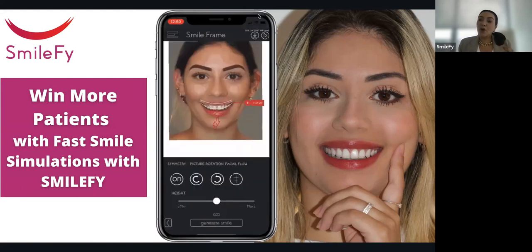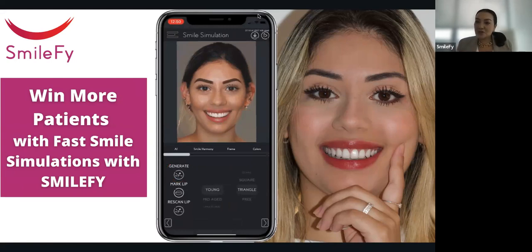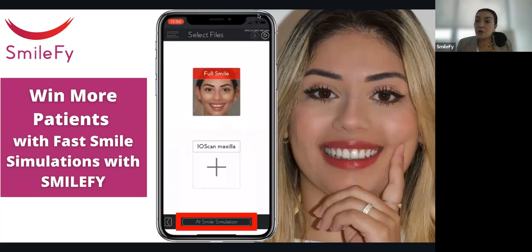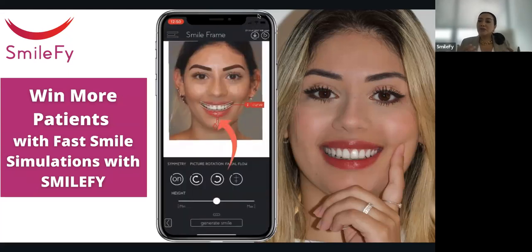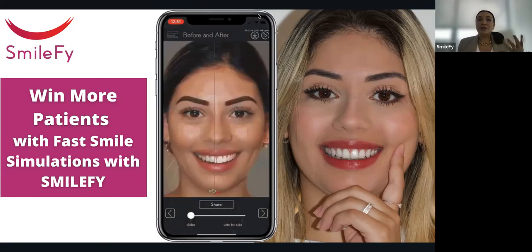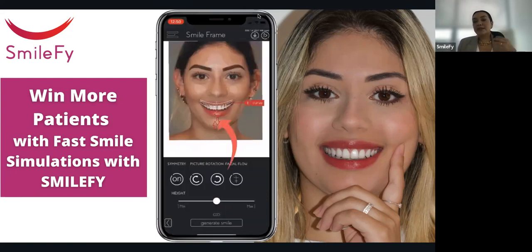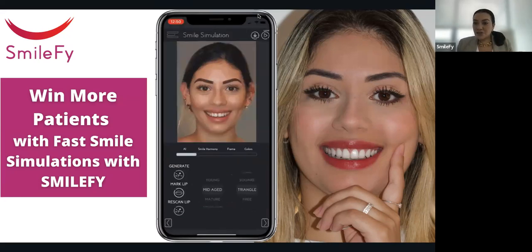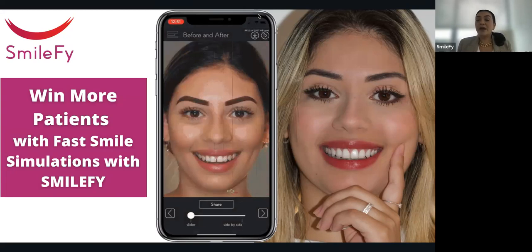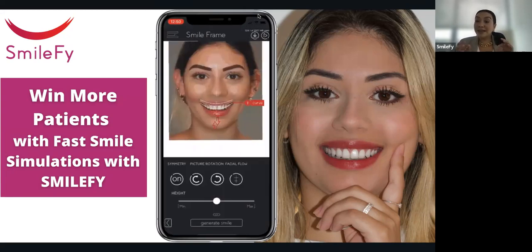And this is something that you can also register and use as a strategy to present your cases to the world, to social media, for example, or to use as a strategy for recall patients. I know a lot of stories here in the office of people who had their smile changed through WhatsApp. Believe me, the doctors are sending messages, the patient sends pictures when we do simulations, and you end up doing the first consultation through WhatsApp. And with virtual consultations, this is a nice tool to engage with the patient.